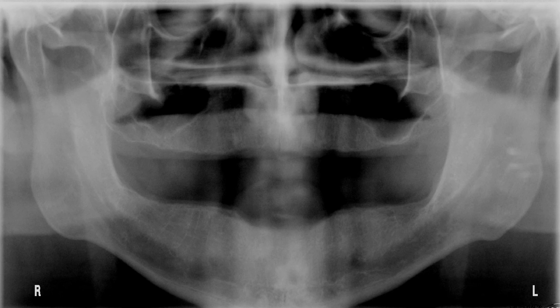Hello everyone, here's the quiz of the day. Please identify this radio-opaque structure that extends from the top of the image all the way down to the inferior border of the image.